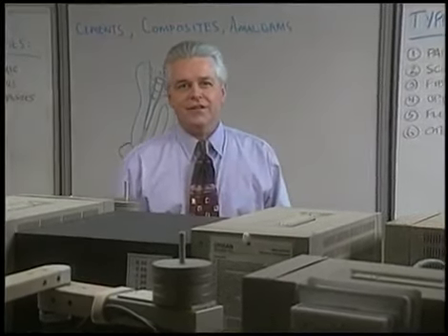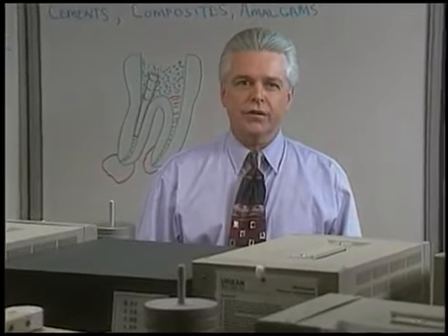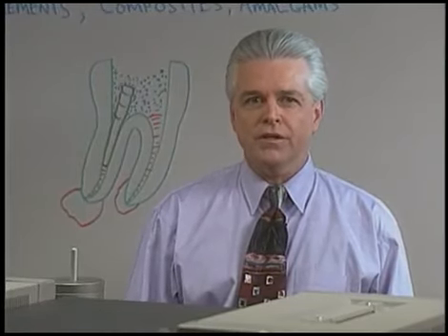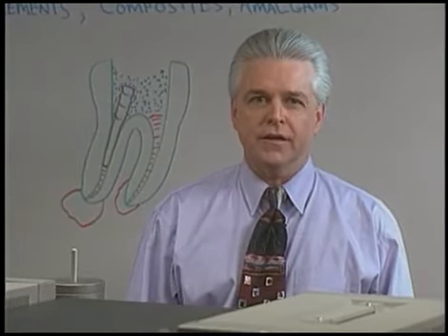Recently, there's been a renaissance in our approach to endodontic retreatment. The great news is we can generally, non-surgically remove post and broken instruments with today's technology. Hi, welcome to Ruddle on retreatment. Today we're going to focus on the non-surgical removal of post and, a little later, broken instruments.